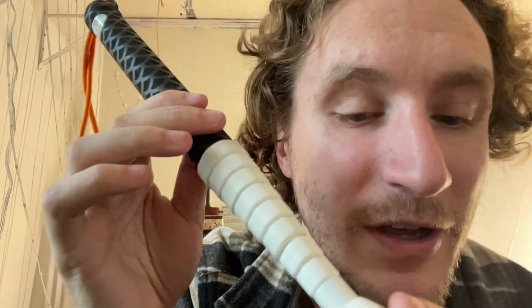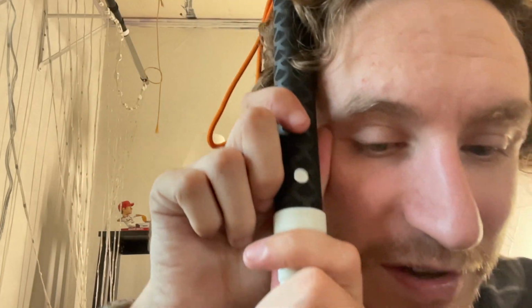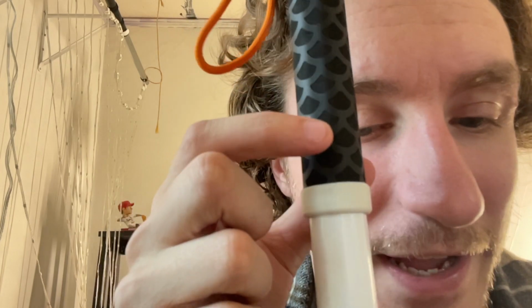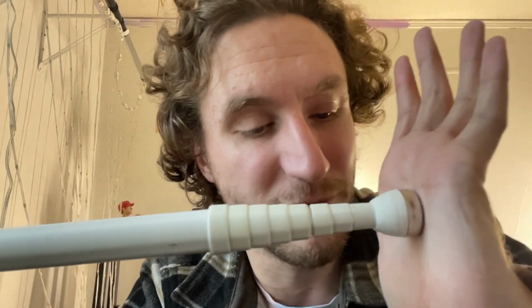key feature. So if I go ahead and show you the rest of the cane here, it's a telescoping cane, so I can take this bottom section and pull it, and you may have heard a click. And the reason you heard a click is that there is now a small peg in this hole, and it has put these two together. So I'm going to do the same demonstration I did a moment ago with my hand. This is not collapsing. I am now pushing on it as hard as I can, and it's not going anywhere, okay? That is this cane's feature.